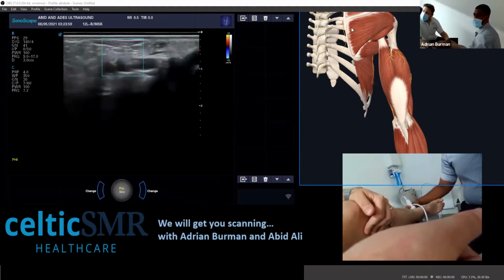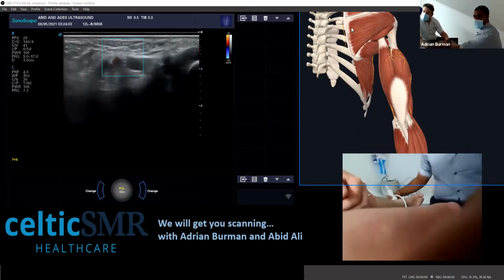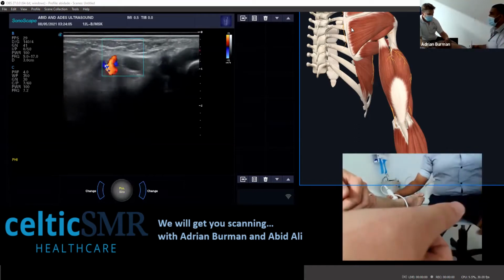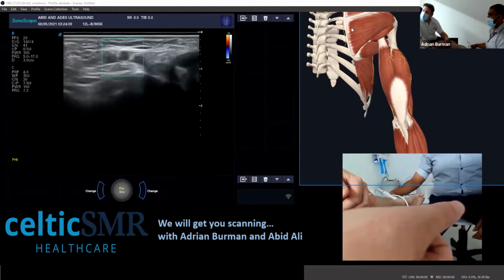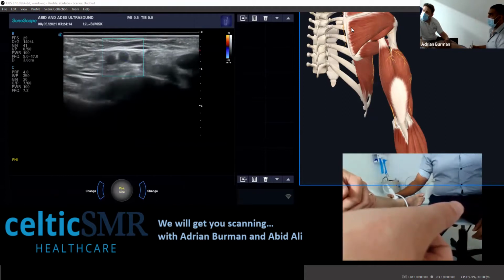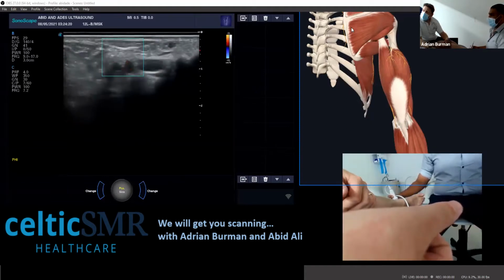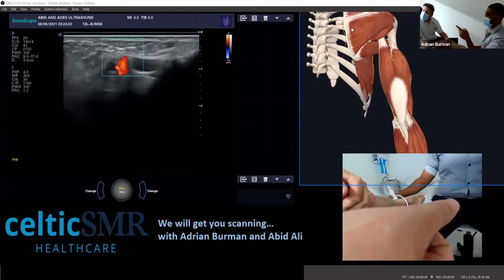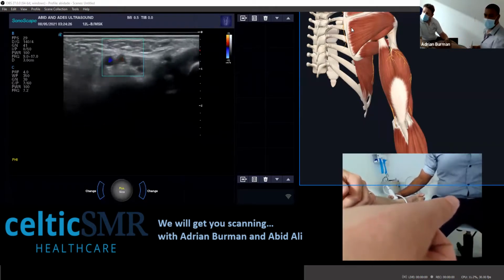This is your neurovascular bundle, on the medial ankle here. Just to show you an easy vessel to get to. And there's Adrian saying if I angle away from the probe, that's blue. And if I go up towards the head, it's showing red. It's also nice to be able to help differentiate sometimes between a nerve, a tendon and a blood vessel if you've not quite got your imaging right.